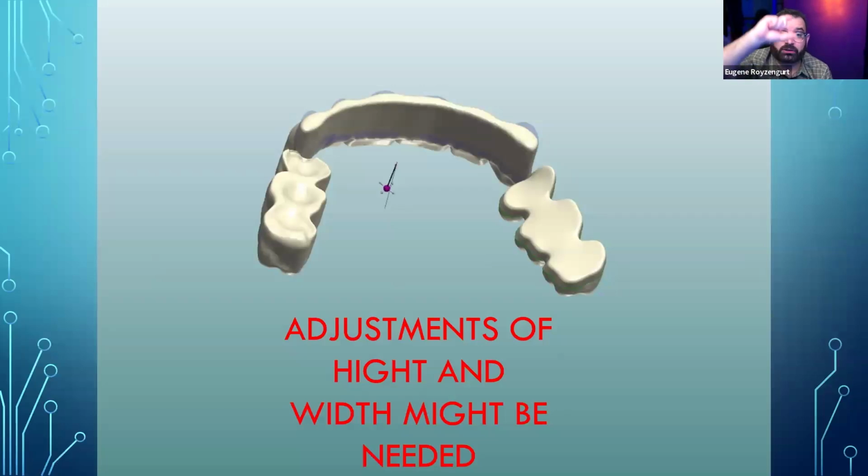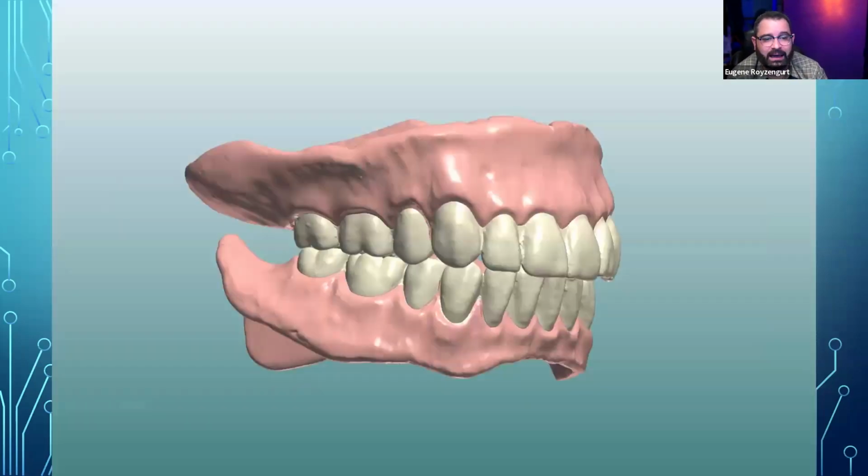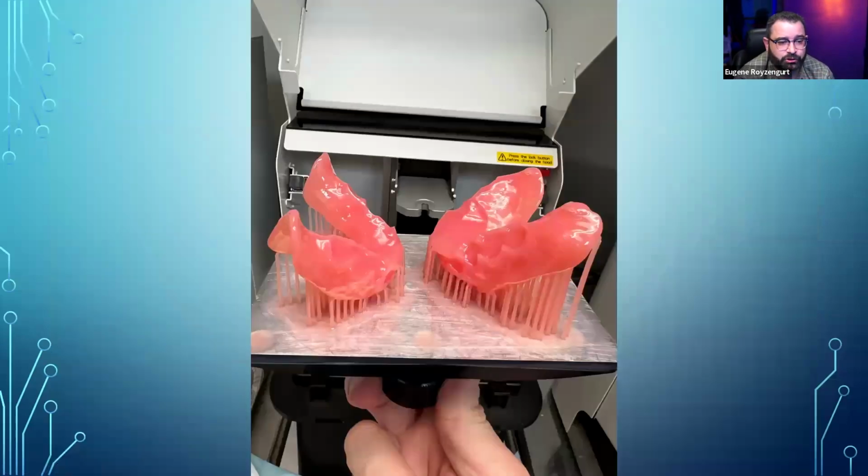Now, a lot of times they'll give you a really tall height, and that can create perforations through the base and throw up errors. So a lot of times you will have to actually adjust the height of the teeth, and then we'll put things together, okay? Looks pretty good, doesn't it? Now, obviously, it's not perfect, but it's easily fixable, guys. So basically what you do is you will print the base plates and the teeth separately.